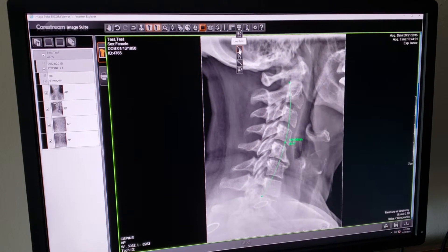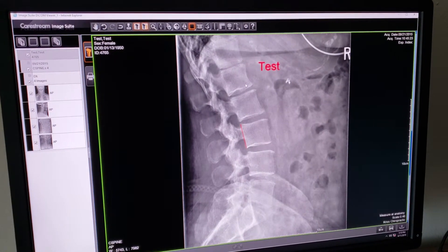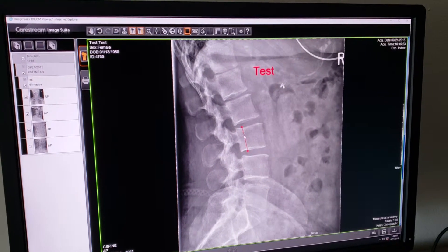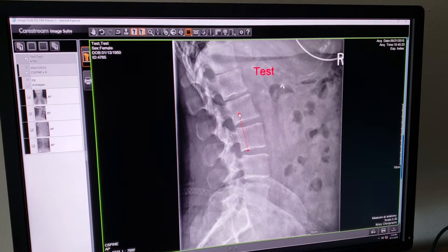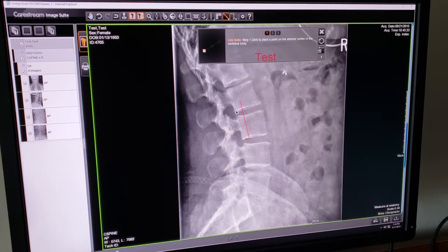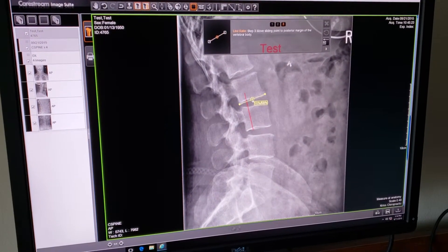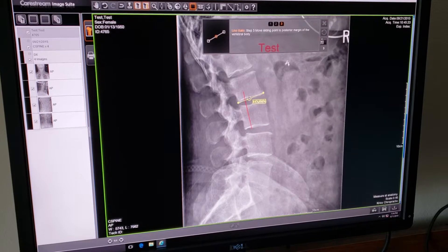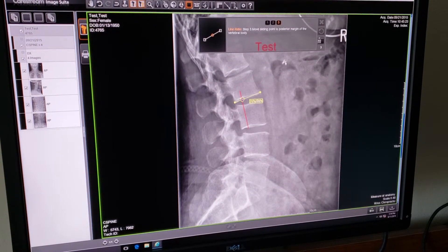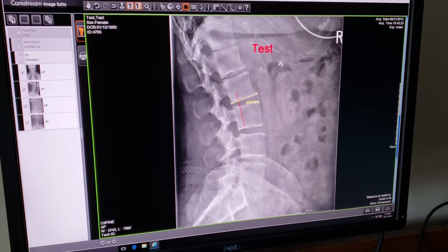The next tool is the line ratio. This was the tool I said we would use in order to grade antero or retro-listhesis. I'm going to pretend that L3 is shifted forward quite a ways, so I've extended our line segment. Using the line ratio tool, placing a dot on each corner — the center dot you can left click, hold, and move your cursor; it will move along with it. You can intersect the red line and it will measure percentages, so you can grade one, two, three, or four.